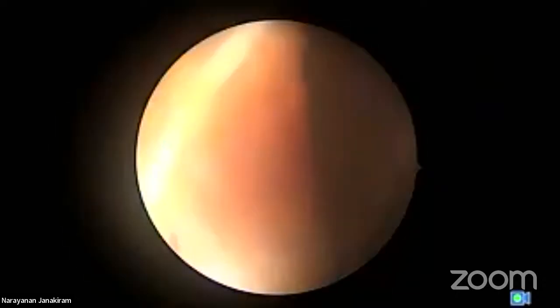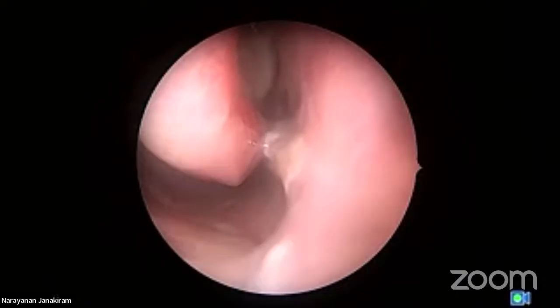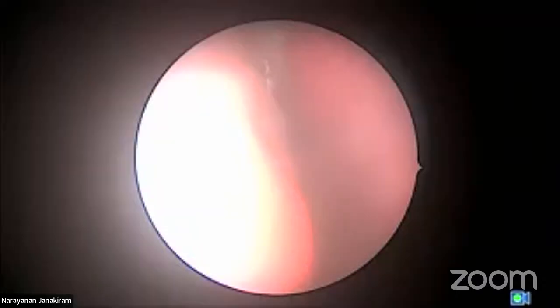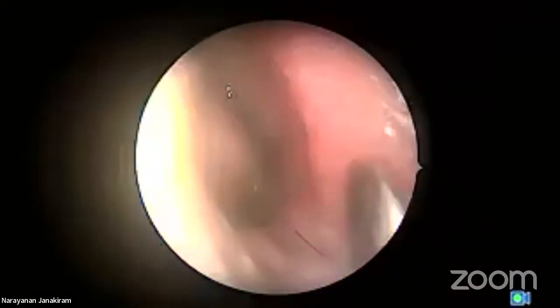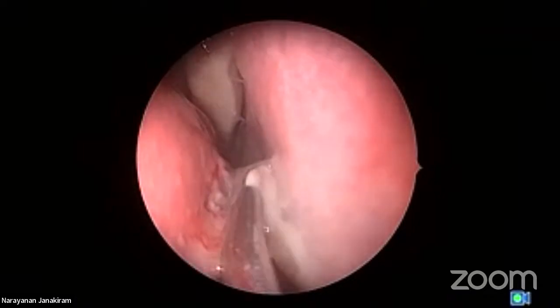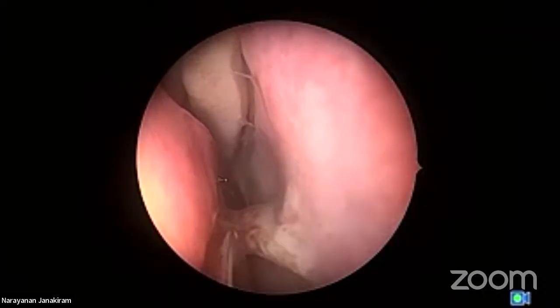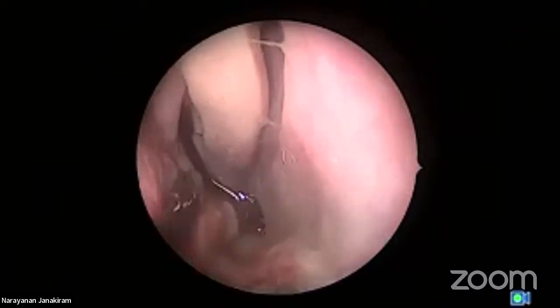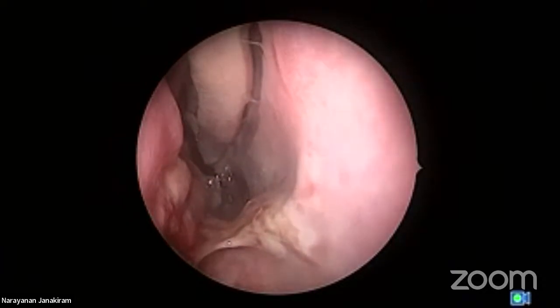We'll have to do a diagnostic nasal endoscopy, which I'm going to do right now. He was packed elsewhere and sent here. Always don't pack a case of epistaxis — even preoperatively, don't pack. See here, this trauma is because of the packing. I'm now going to show you what is the cause of his epistaxis. Whenever you see a case of epistaxis with suction, always go towards the nasopharynx — that is formula number one.